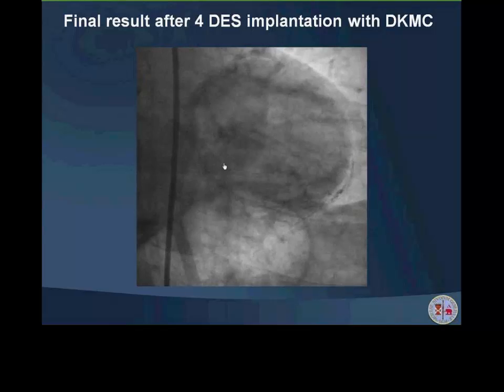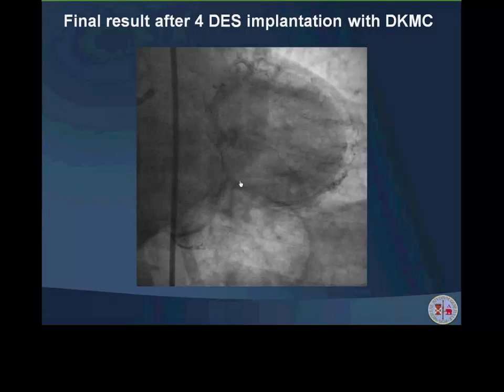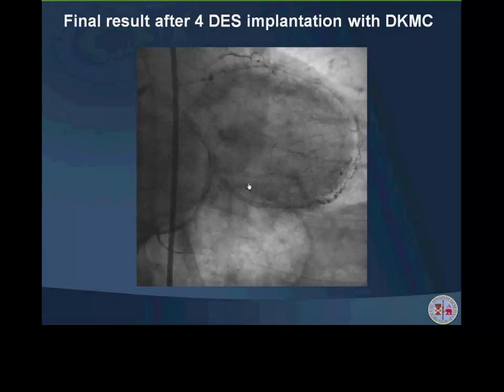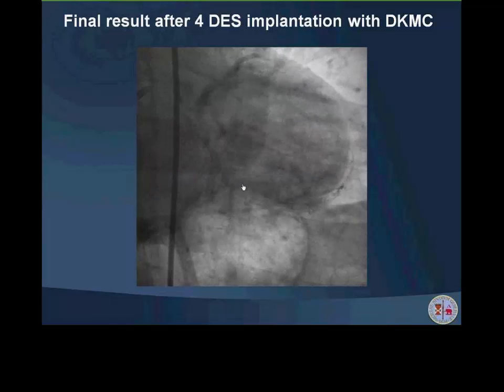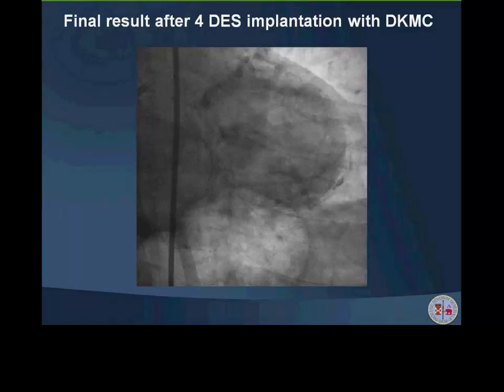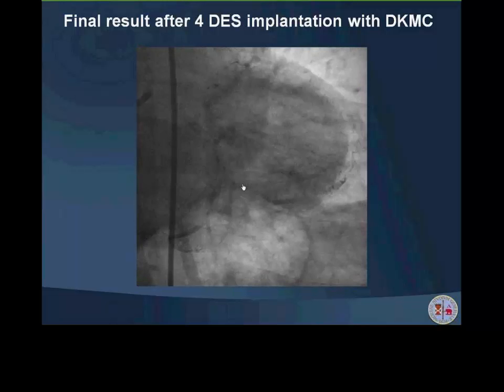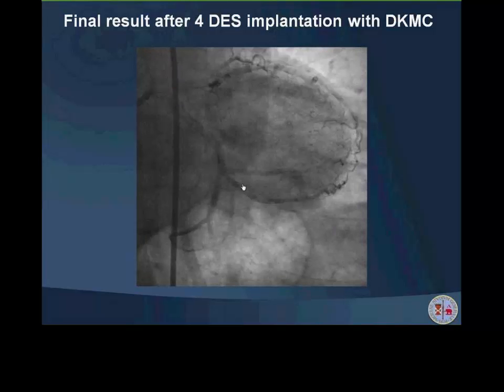Most of the other times this does not really happen because it's sometimes difficult or complex, and anyway you are really very close, and then pushing the soft polymeric wire, you will re-enter very easily. This is because the distance between the tip of the RX and the distal tip of the OTW is not so far, and allows you to keep the two, as we were doing in the parallel wire technique, very close to the inner part of the lumen.